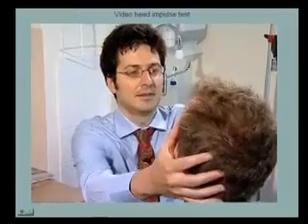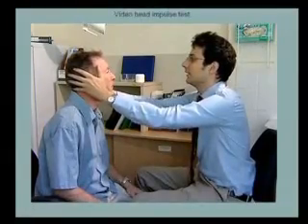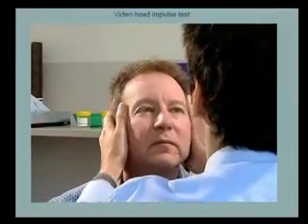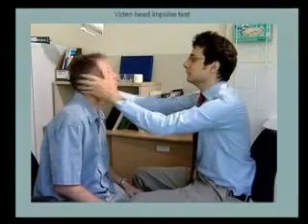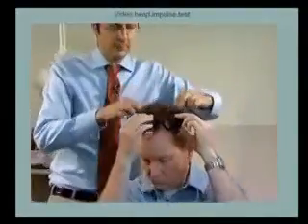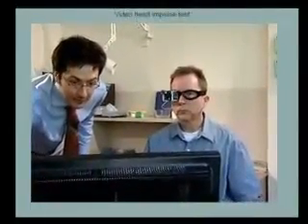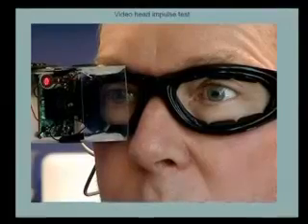This is how the video head impulse test is done. This whole test can be done with video. Overt saccades, which occur after head rotation, are the telltale sign of canal paresis, whereas covert saccades, which occur during head rotation, are not detectable to the naked eye. The patient puts on the lightweight video goggles and then looks at the center of crossed lines from a built-in laser to calibrate the entire system.